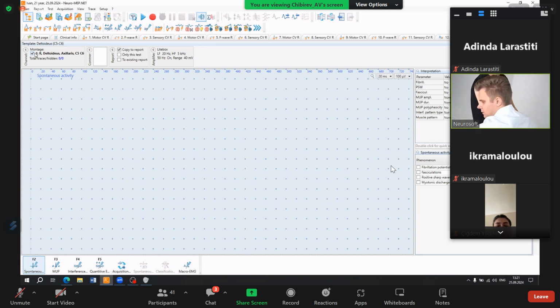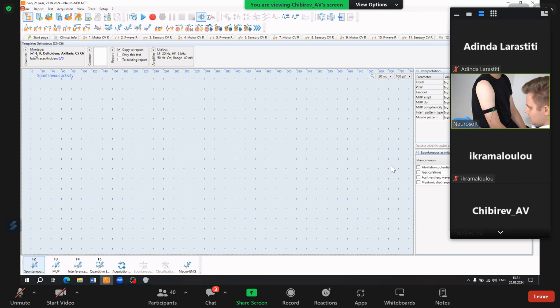The stimulator isn't needed any longer. You can see that there are no settings for the electrical stimulator because we won't use electrical stimulation. And now I need to put on gloves because this technique is invasive, and I should care about my patient. I don't want to hurt them. After that, I will use a tissue with alcohol to prepare the patient's skin. Okay, this one.